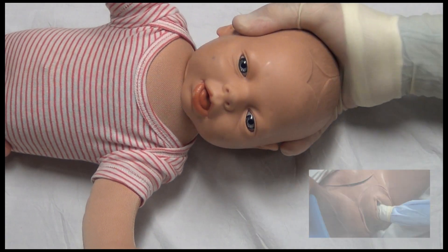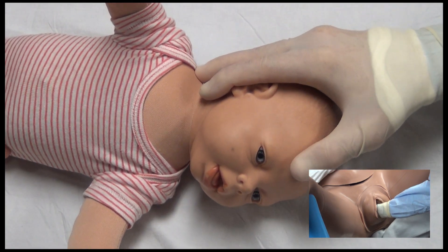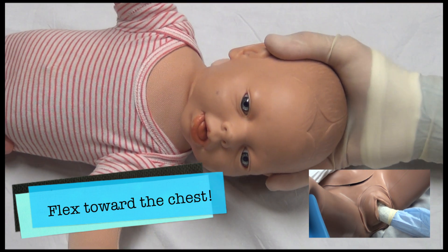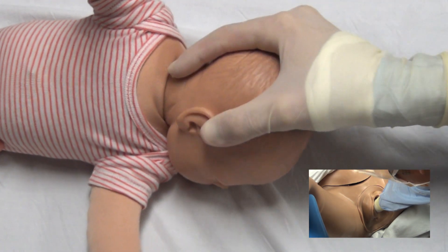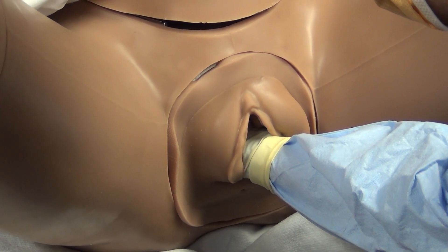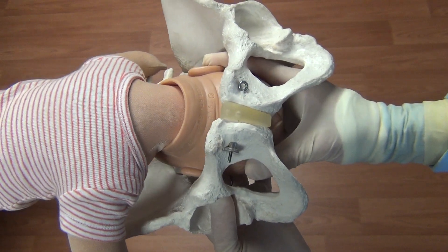Rotation of the fetal head is accomplished through pronation of the examiner's hand. Often at the transverse position there is some resistance. The operator can move the hand back to the supinated position and re-grab the occiput. Slight flexion of the fetal head toward the chest will assist with the next round of pronation of the examiner's hand and lead to the complete rotation of the fetal head to an anterior position. We normally hold the fetal head in the anterior position over the next two contractions, where the patient is asked to push, allowing the fetal head to be brought back down into the pelvic outlet where the occiput can be brought under the pubic bone.